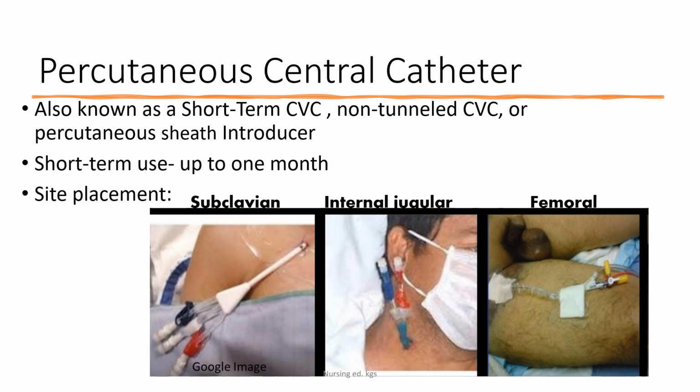and they can be placed subclavian, internal jugular, or femoral. Femoral is often shied away from because it is associated with higher risk of infection, thrombosis, arterial cannulation, and is also contraindicated if the patient is going to need parenteral nutrition.